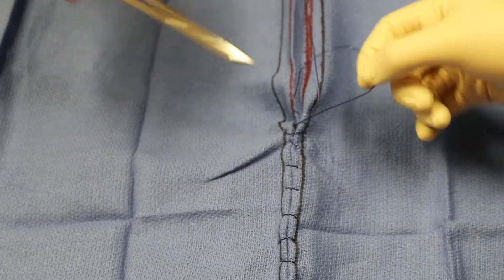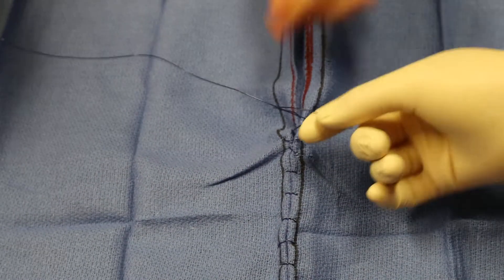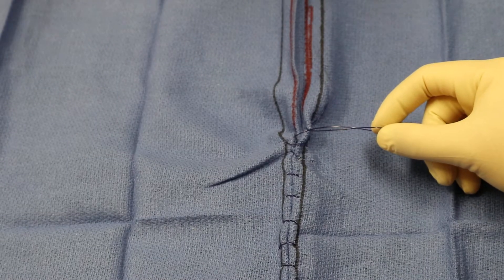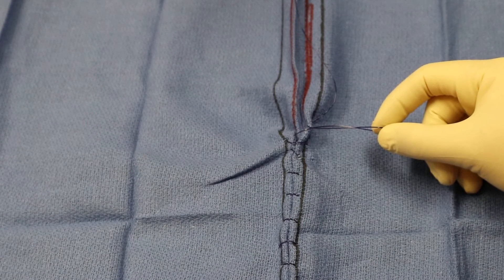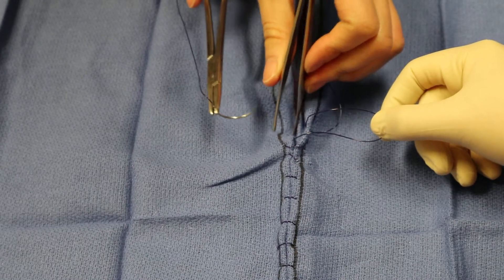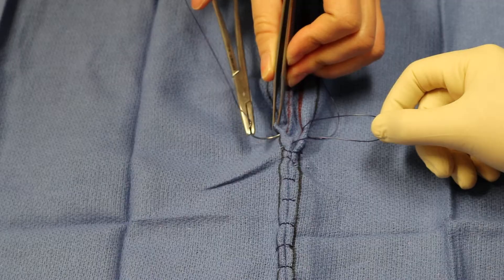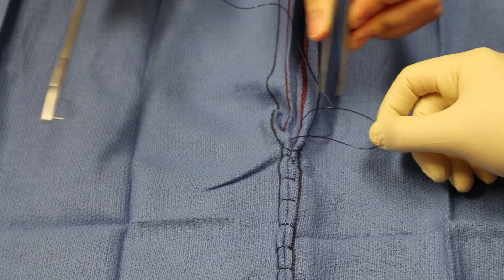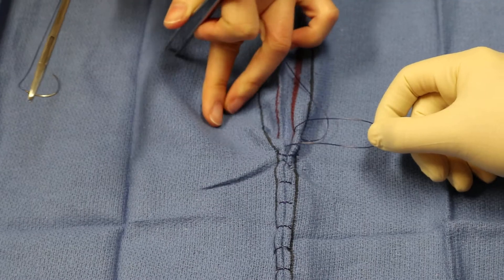Now the piece of suture with the needle on it is back to being superficial because it's coming out that deep to superficial bite. So you want to take one more bite going from superficial to deep. Superficial to deep is the red line to the black line, and it's not deep and superficial yet, but it will be when you pull it tight.